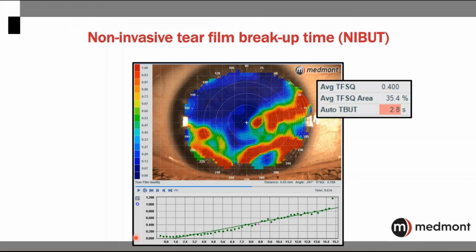This tear film surface quality assessment, of course, is critical to dry eye practice, but it's also useful when mapping over top of contact lenses that patients may be complaining about wetting. You can then compare multiple different lenses to see which ones wet in very short order to determine what might be the best plastic for a particular patient.